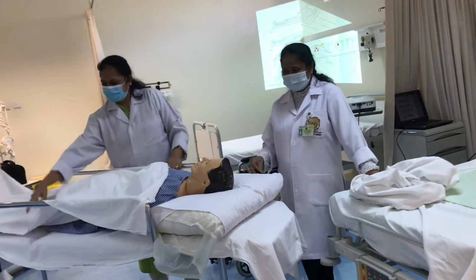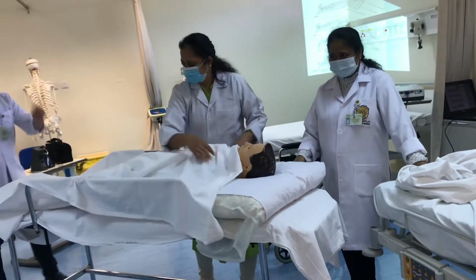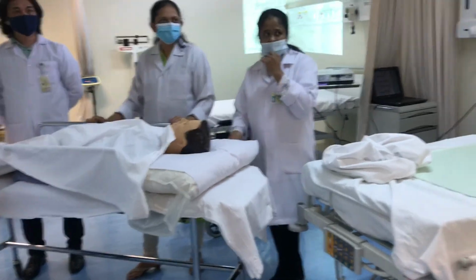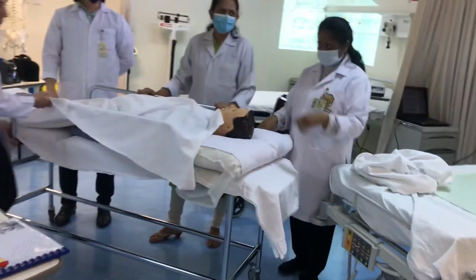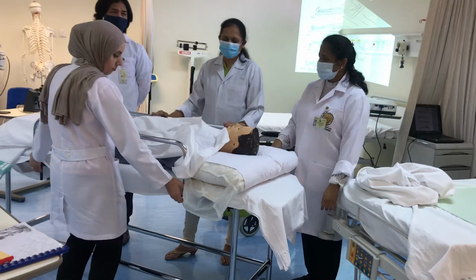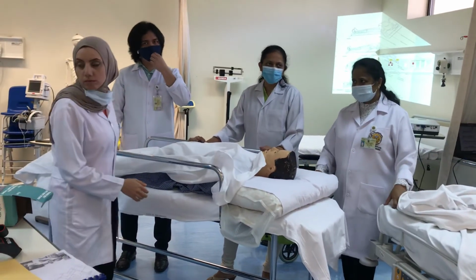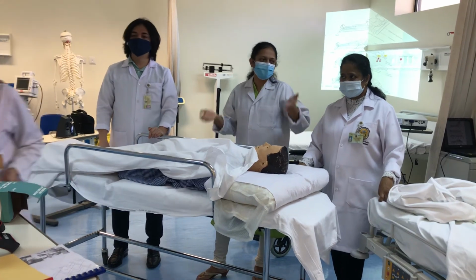It's dangerous. Yeah, risky. But good to show them so you know when they need it. Maybe you can do it by group of students. All 4 students. It's like what we did by 4 students or by 3 students. Involve the students, first they learn from that.